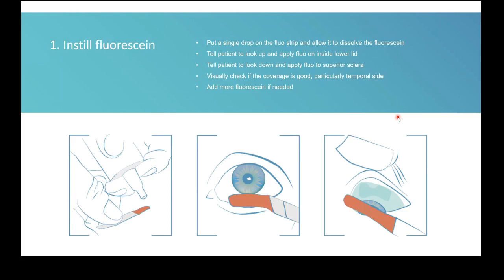So often we do see that you have to take care of your dry eye patients. That means instruct them to use drops, or at the moment that they come in, before you take the measurement, already use a drop just to make sure that the eye is getting wet. So we rely on fluorescein and we rely on a good tear layer.